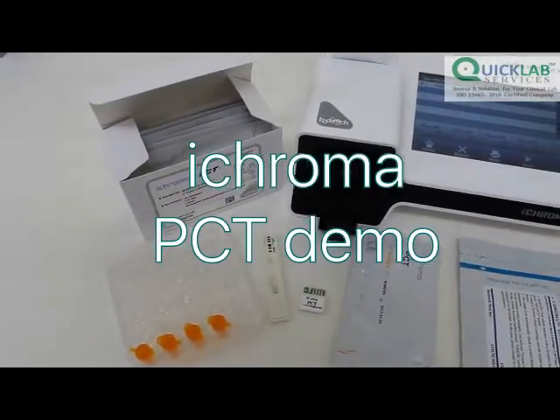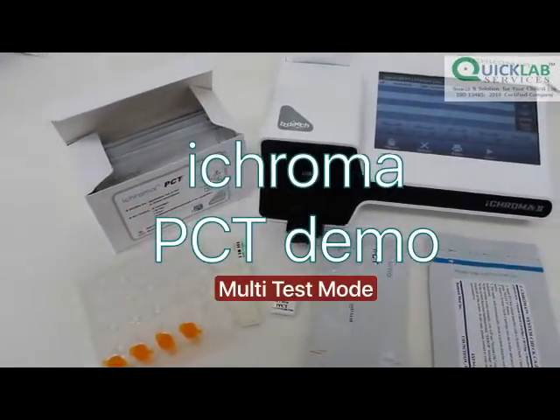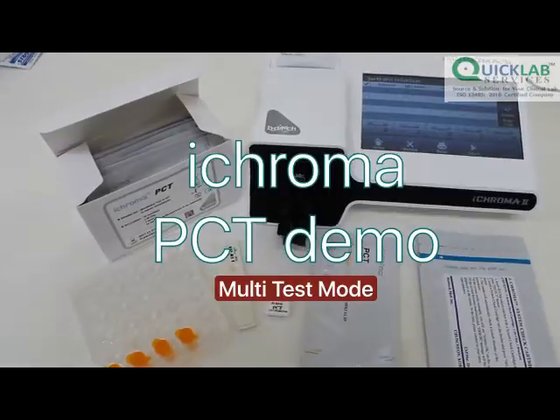In this video demo, we will be testing the level of PCT in a human sample using multitask mode.